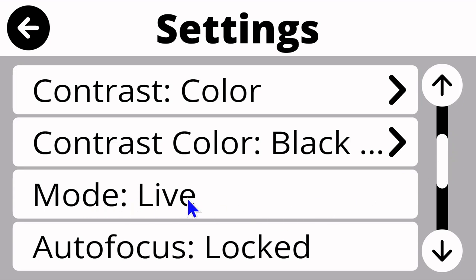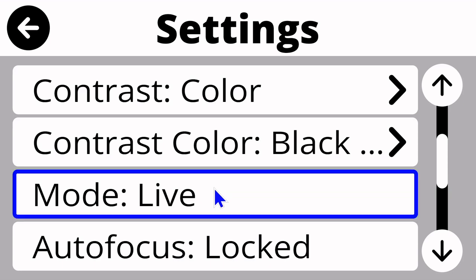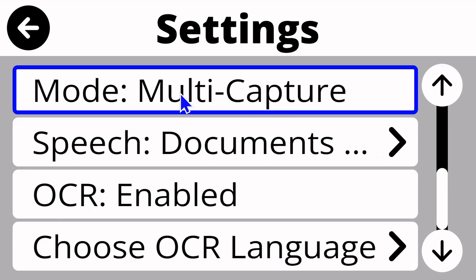And remember, our mode is live. When we're live, we're seeing one page, we're seeing it live to do what we want in a live viewing mode. If we choose to do a capture, it's going to capture only that one page or that one thing that we're looking at right now. There is another option there if I click onto this, and we will move into a multi-capture mode. I see the other options that I've had previously, so I can adjust those if I would like to, but I want to show you what the meaning of a multi-capture is.